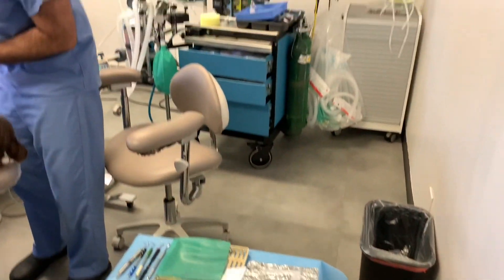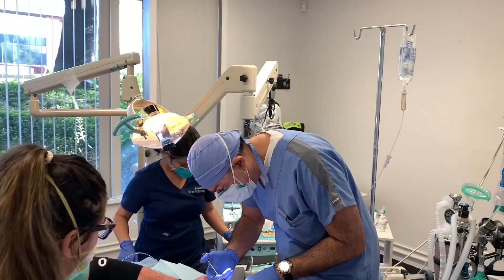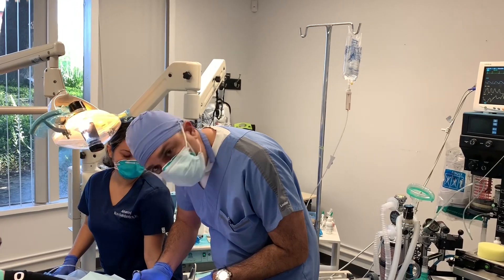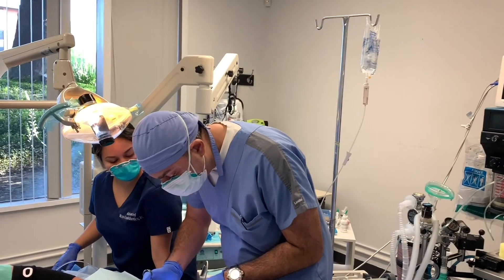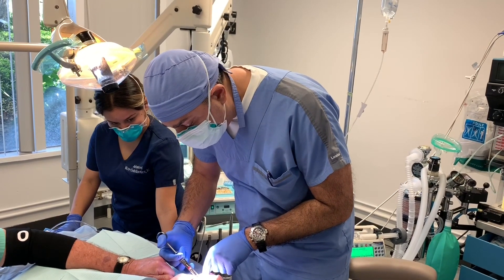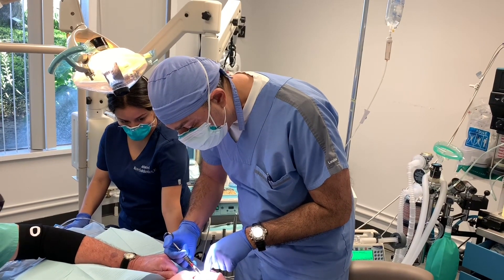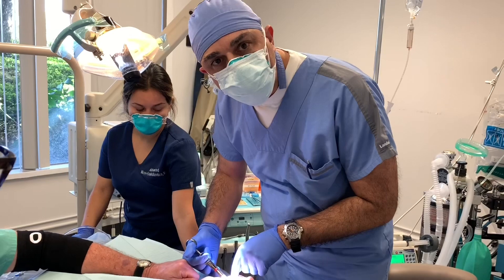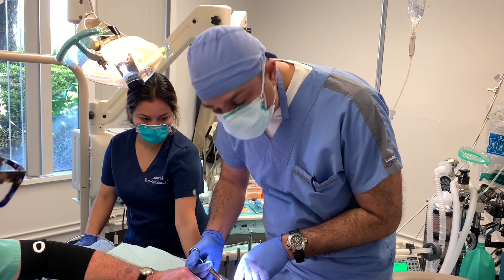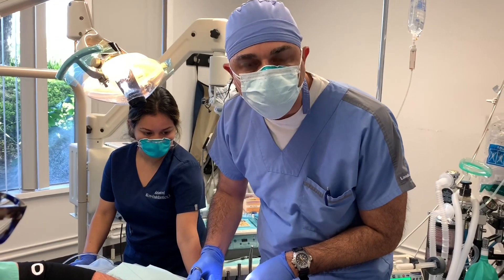We're going in with a buccal infiltration using lidocaine 2% with 1 to 100,000 epinephrine on tooth number two. I always give a palatal infiltration as well — always. I'd rather patients suffer for a few seconds than feel the rubber dam clamp and everything else.